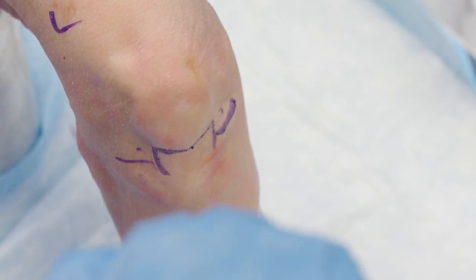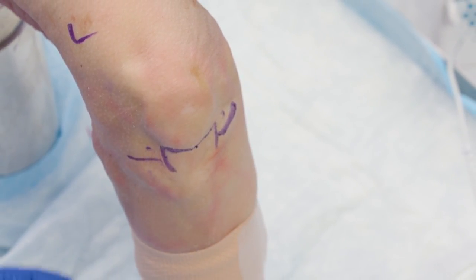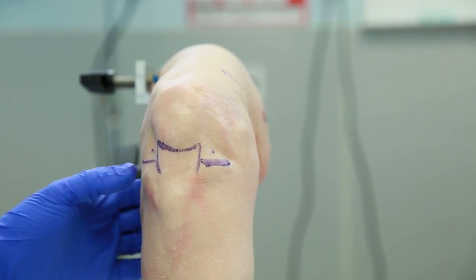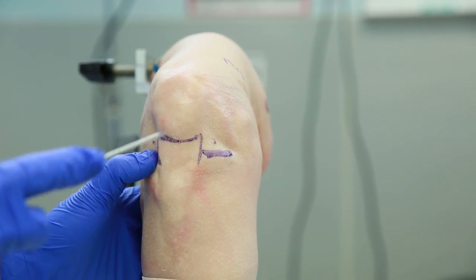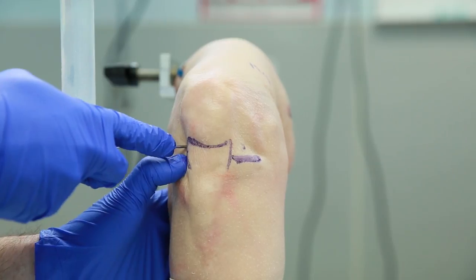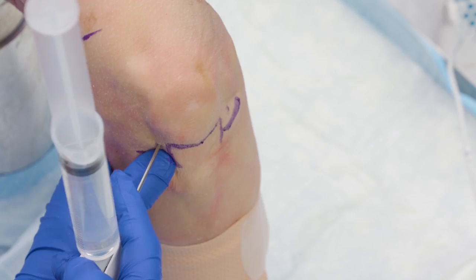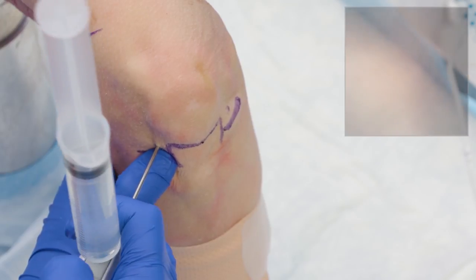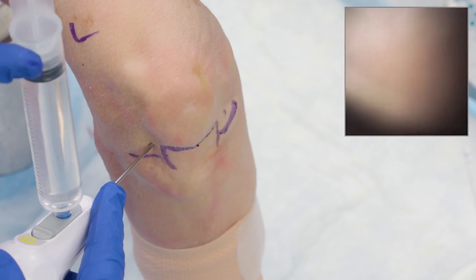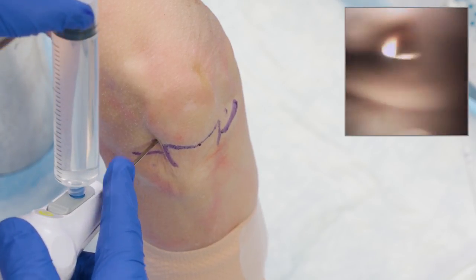For the purposes of this, we've already anesthetized our patient, and I'll start by entering from the lateral portal. Just like in surgery, it's good to have a routine so you don't miss anything. This is a 14-gauge needle — I'll hold it with a little finger choke-up and aim right for the intercondylar notch as I push in. Aiming for the notch is reproducible and helps prevent iatrogenic cartilage injuries. Once I'm in, I'll retract, which helps get around most of the fat pad and brings me right to the ACL. From here I can squeeze through and get over to the medial side if needed.